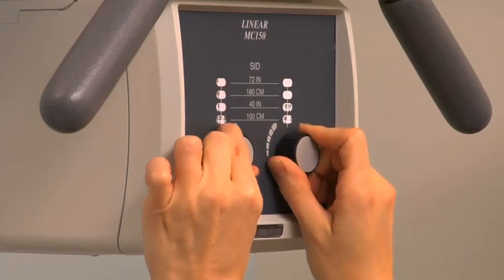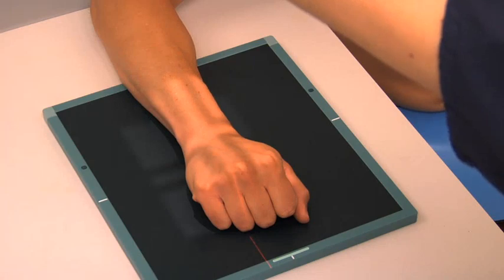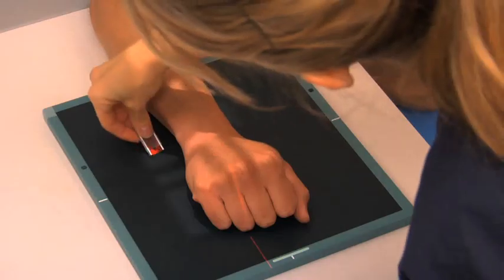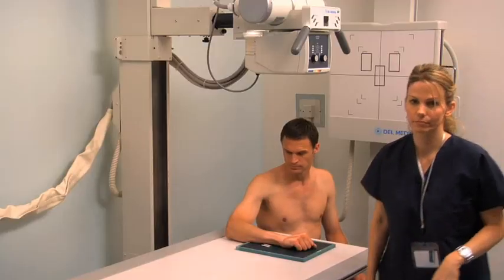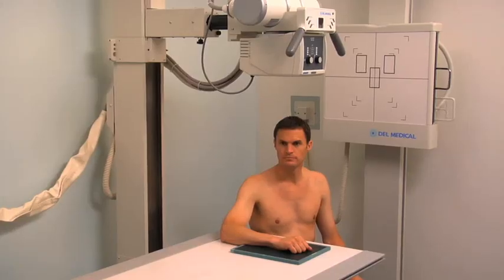Center the central ray to the mid-carpal area. Collimate to include the distal radius and ulna, carpal bones, proximal and mid-metacarpals, as well as the soft tissues of the wrist. Position the lead marker appropriately. Move behind the lead barrier and adjust the exposure settings if necessary. Prepare and expose the cassette.